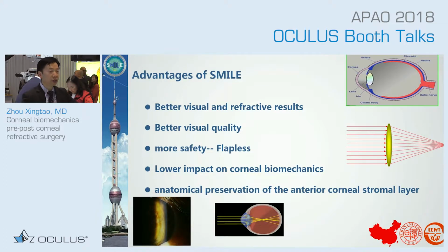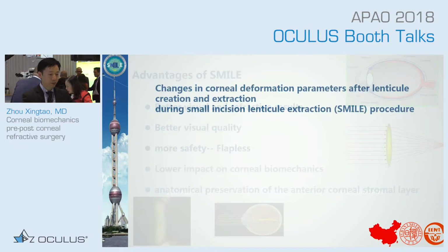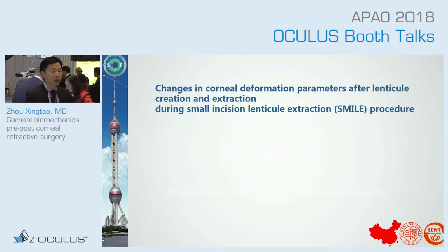The advantages of SMILE were better vision, better vision quality, and more safety, with low impact on corneal biomechanics. Here I would like to present the change in corneal deformation parameters after lenticule creation and extraction during the SMILE procedure.